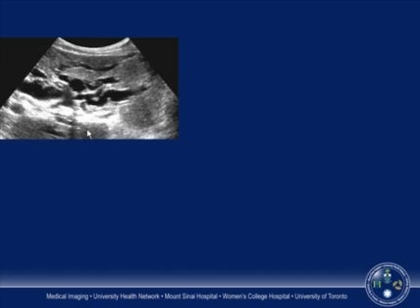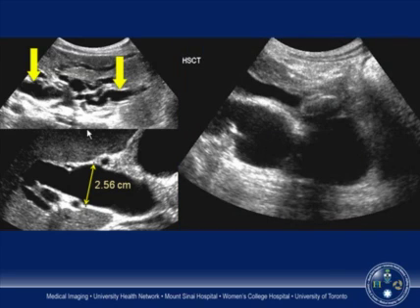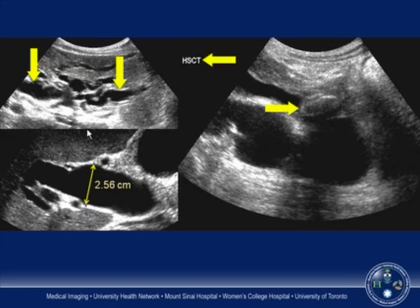A patient presented to emergency with acute right upper quadrant pain and notably abnormal liver function tests. Intrahepatic bile ducts were markedly dilated, and following them centrally revealed a markedly dilated common bile duct. Following the dilated duct to establish the level and cause of obstruction revealed a large gallstone. Important note: on SONO-CT, the stone may not exhibit the expected degree of shadowing because the multiple angles of inclination disperse the shadow.